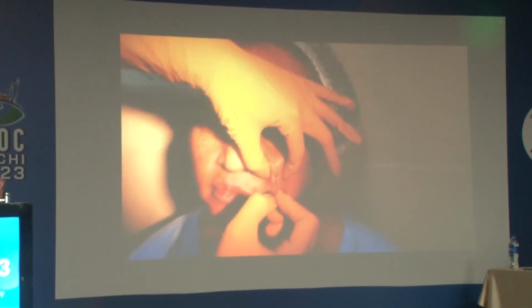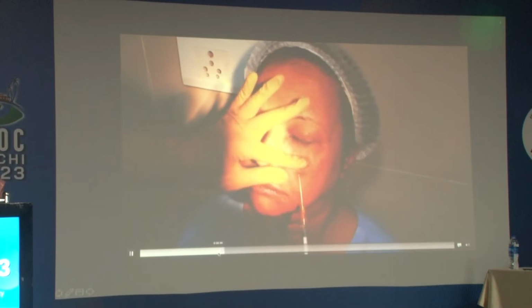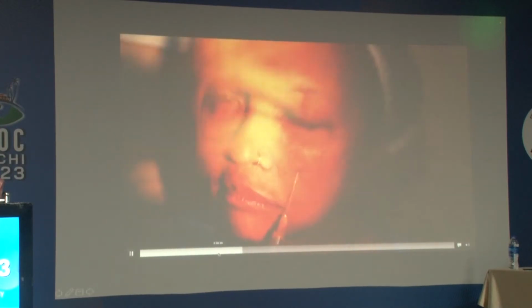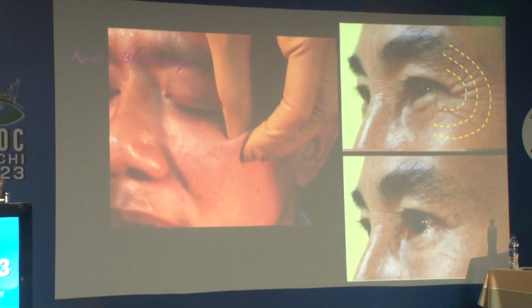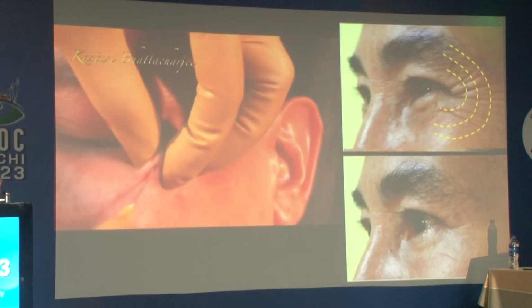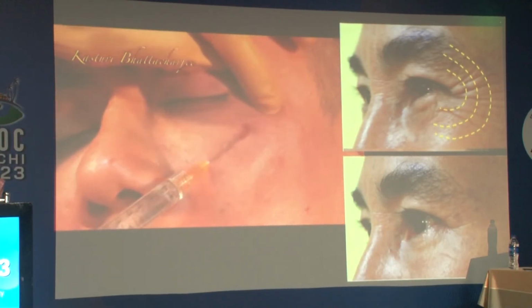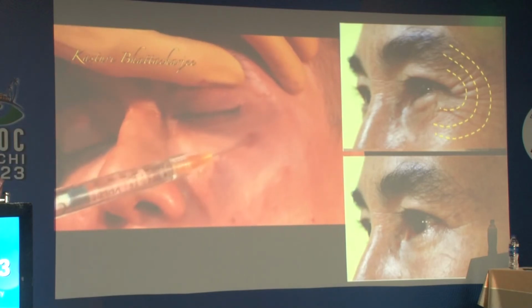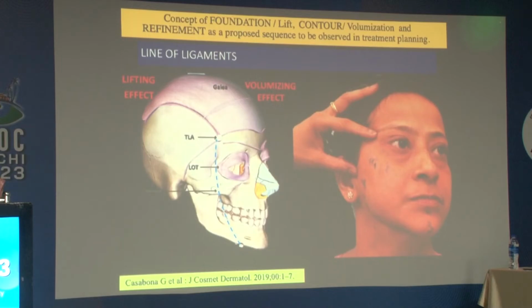Along with the other indication besides the periocular region, this is also under the patient where you inject the filler. This is with the cannula. You can do a very good injection, very good effacement of the lid cheek junction, and this is a beautiful product. Sometimes in crow's feet, there are patients with static lines who do not work well even with injection botulinum toxin. So along with the toxin, if you can do a little bit of myomodulation by injecting the dermal filler, you can really do very well.